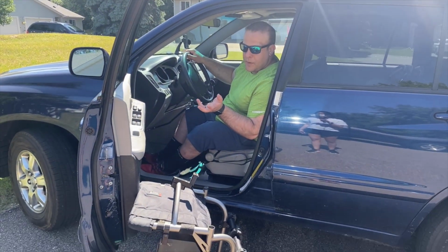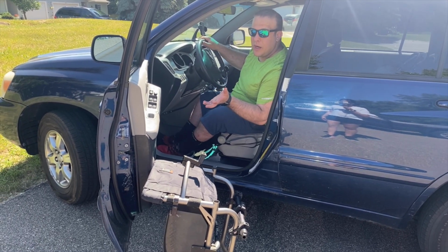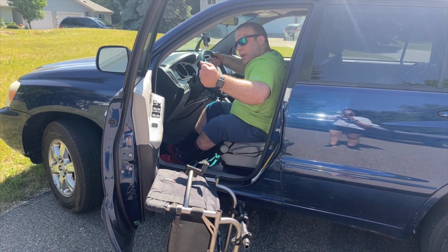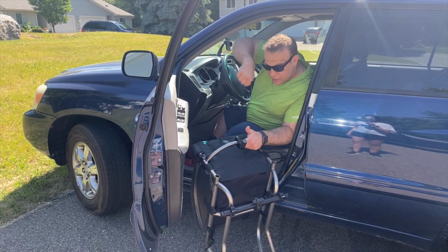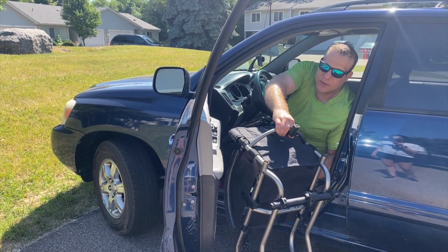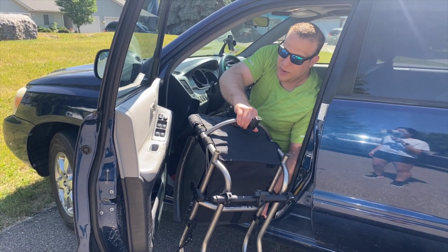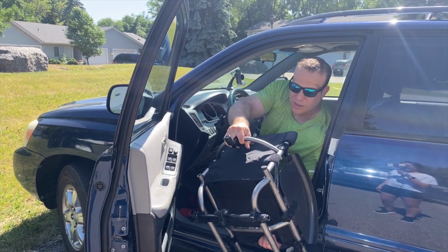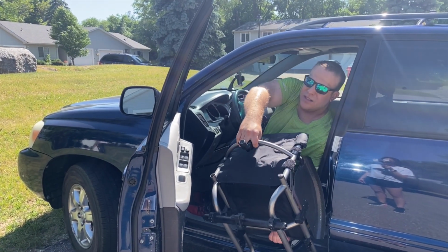And then this, I had some shoulder trouble last year, and so I'm trying to be a little more cognizant about not just grabbing it and going. Instead of being way out here and just yanking it in, I'll scoot it back in a little bit and then reach across, and then instead of just doing this with one hand, which I used to do admittedly, we lift with both hands. Most of the weight of the chair is in my left hand right now. My right hand is guiding, but the lifting is done by my left hand, because that's a more natural movement for my bicep as opposed to using my arm way out here, that's tough on your shoulders.